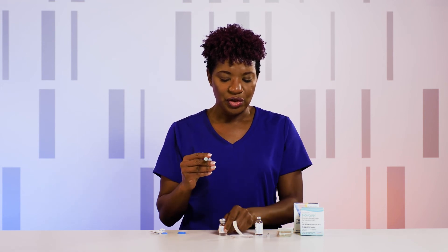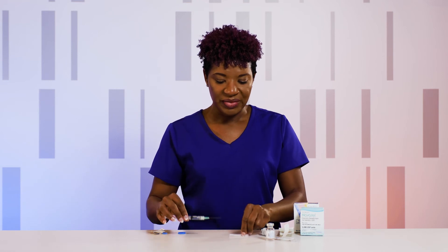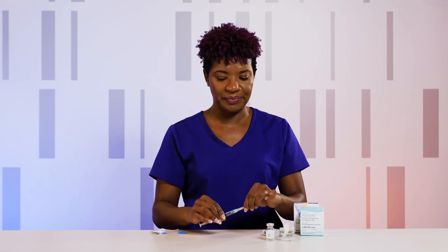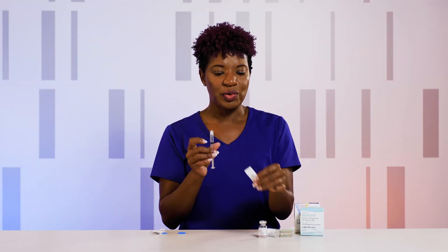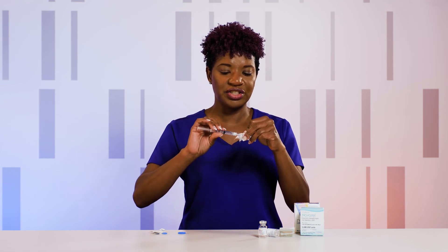Pull your needle out. Recap the needle by scooping the tip of the needle into the cap — never bring the cap to the needle, as you want to avoid sticking yourself. Once the needle is on securely, go ahead and unscrew the needle by turning it counterclockwise. Grab your needle that you're going to use for administration and screw it onto your syringe.